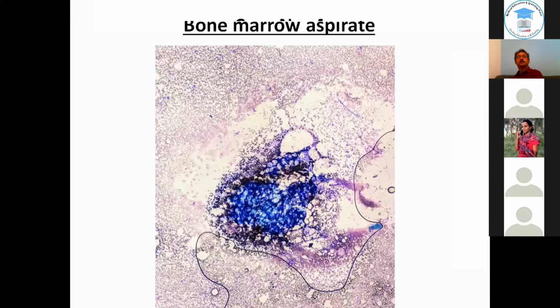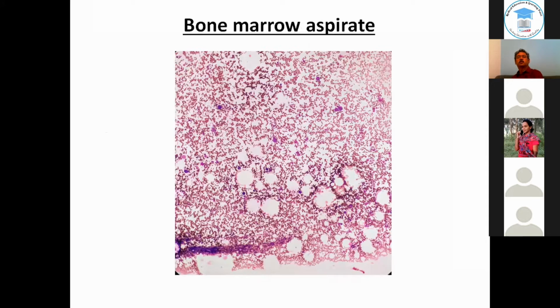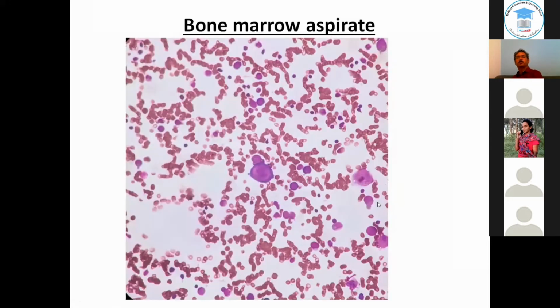And here is the bone marrow aspirate, which is, well, nothing much in this. Again, just some fat out here, nothing much. Okay, at this magnification, actually, it looks like you can't see much, but because I know what the diagnosis is, I noticed that there's something going on out here. Cells which are slightly bigger than I would have expected them to be, and they're not megakaryocytes, mind you. Again, you can see something out here. So you can suspect it on scanner view.